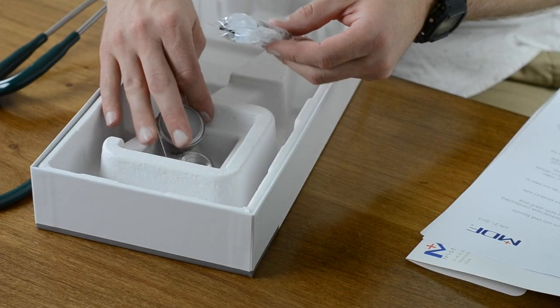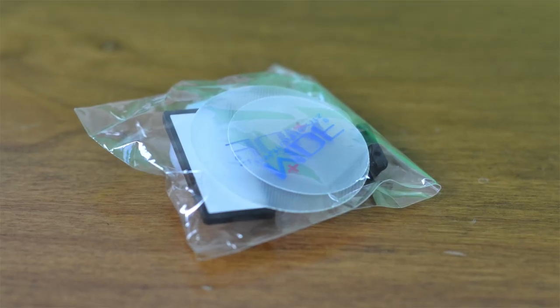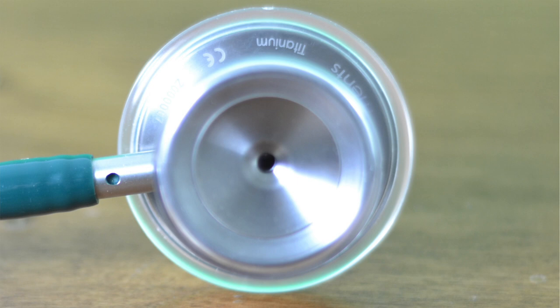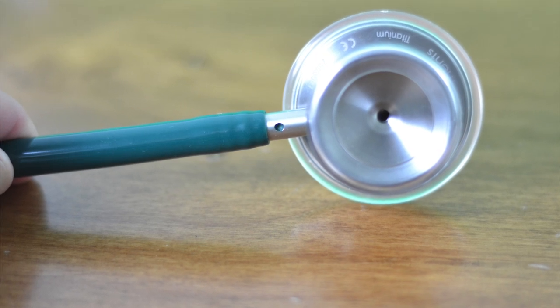There's also a bag with multiple sizes of ear tips, some replacement diaphragms, and it looks like a name badge. Briefly about the build quality from the product description: the chest piece, stem, and headset are all made of titanium. The green dot on the stem shows you which sound channel is activated, and this eliminates the need for tapping, which you'll see almost every doctor in the entire world do before they touch the stethoscope to a patient.